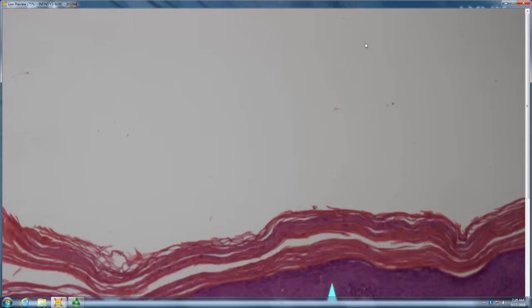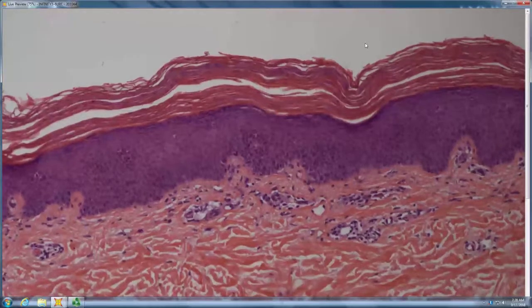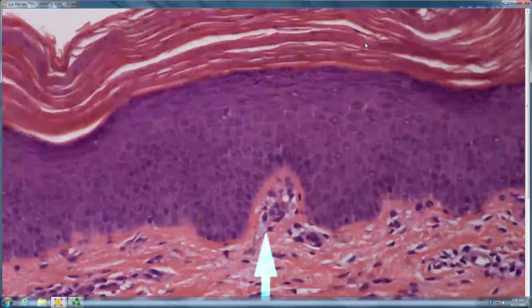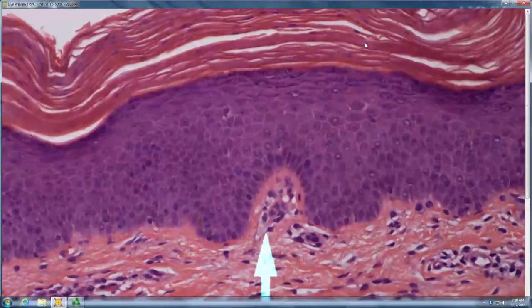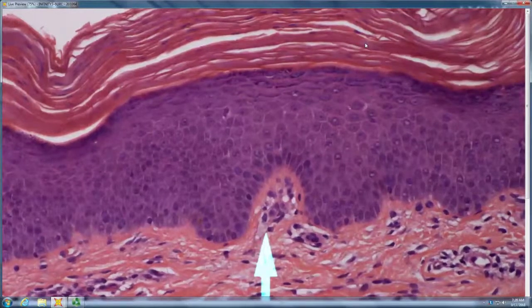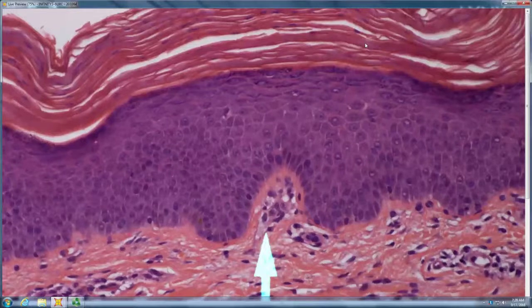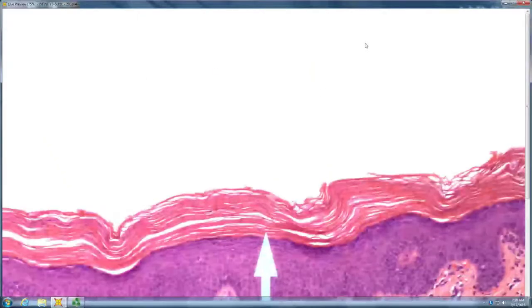Checkerboard parakeratosis, hyperkeratosis. Is there thinning or thickening of suprapapillary plates? It's thick, which would go with PRP. Again, just the opposite of psoriasis, because psoriasis tends to have thinning of suprapapillary plates. Other little things that help, if you look at the vessels, there's usually vascular congestion with rouleau formation in psoriasis, and you don't see that in PRP. So PRP suprapapillary plates are thick; in psoriasis, they're thin. Vascular congestion in rouleau in psoriasis, not present in PRP. Hypergranulosis in PRP. The alternating checkerboard pattern of parakeratosis is characteristic.